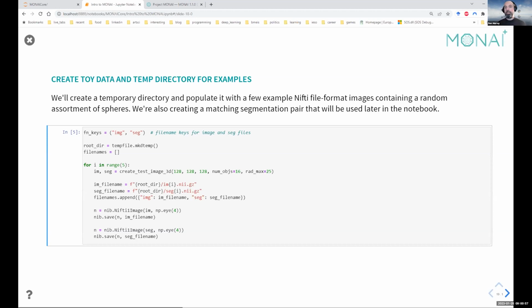And this also allows you to do very useful things like inverting your transforms and getting back to your original data space. Say, for example, if you're dealing with a rotated patch somewhere in a volume, you want to be able to map that back to the original image.